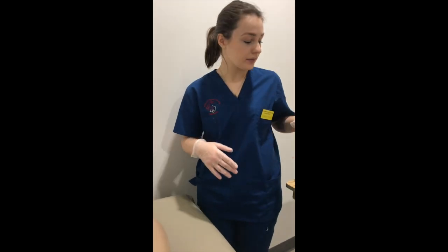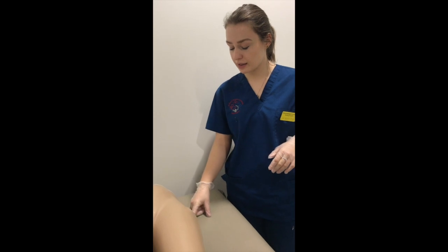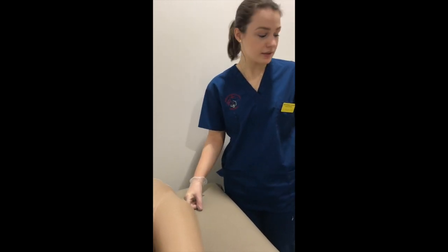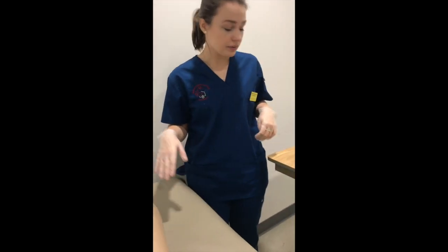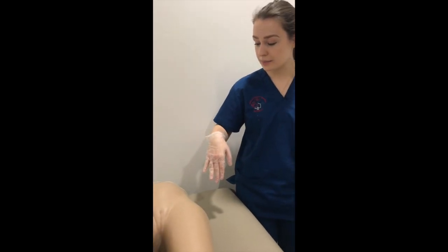Hi, Mr. Mancini. I'm back with the injections. I'm just going to ask your full name and your date of birth so that I can compare it to your bracelet as well as the MAR. Perfect. So now we know that we've got the right medications for you. We're going to start with your injection of heparin, which is going to be in your lower abdomen.